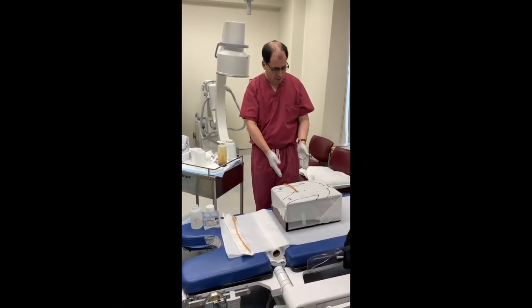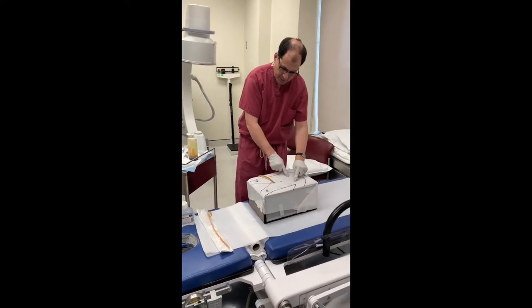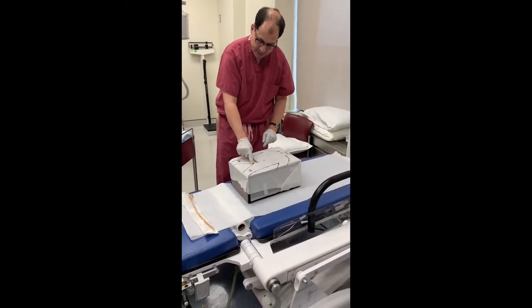Let's look at the patient here. Here's the patient, here's the abdomen, here are the nipple lines, here's the belly button, here's the pubic bone.